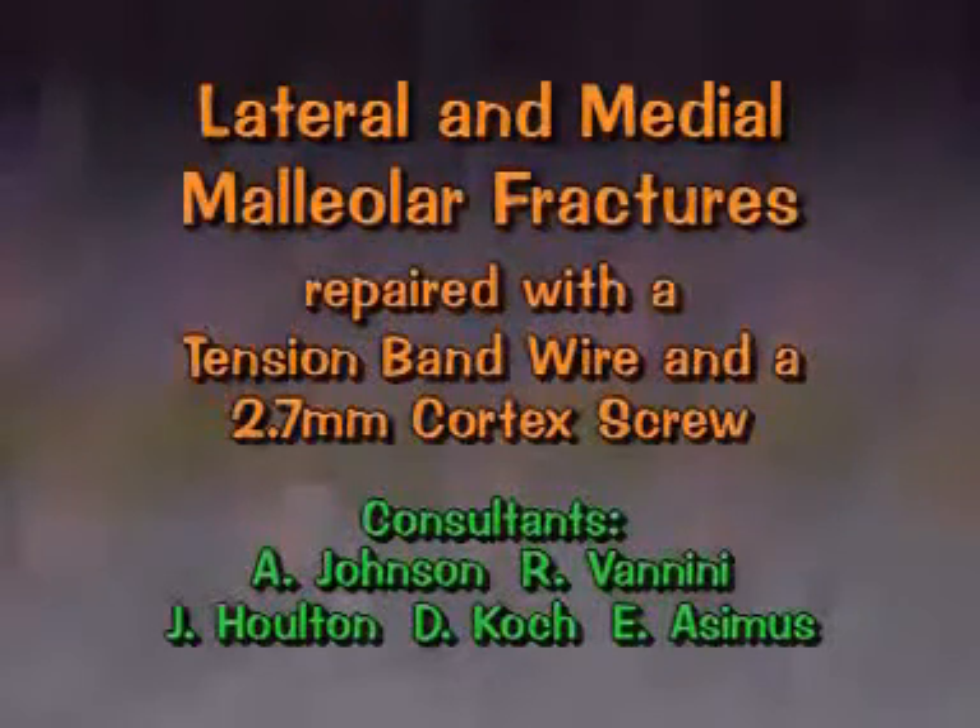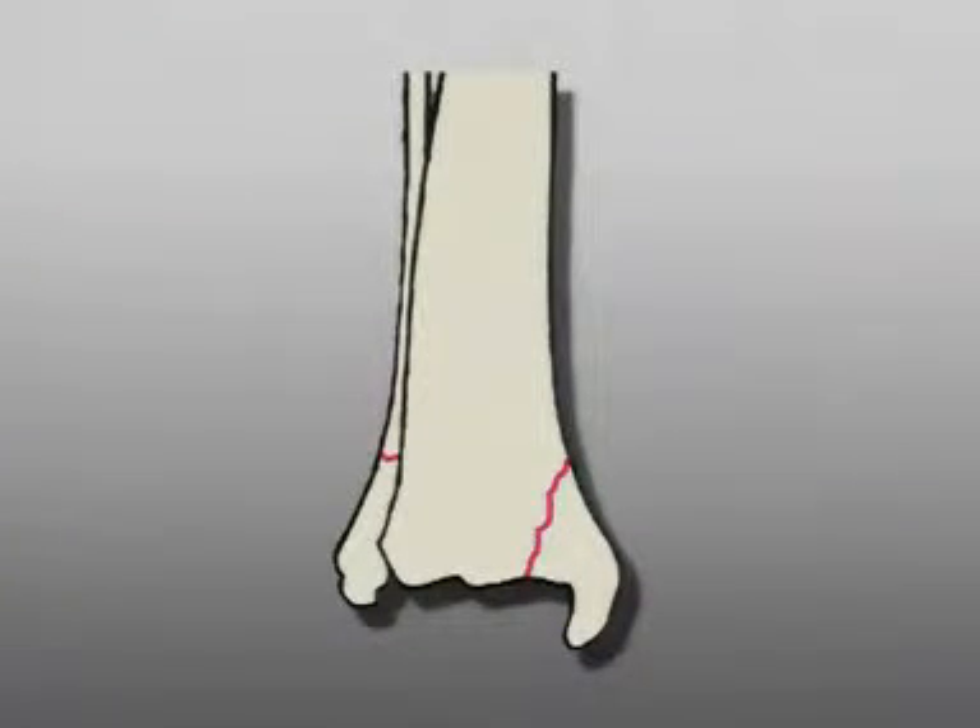Lateral and medial malleolar fractures repaired with a tension band wire and a 2.7 millimeter cortex screw. In this exercise, these are the fractures to be repaired.